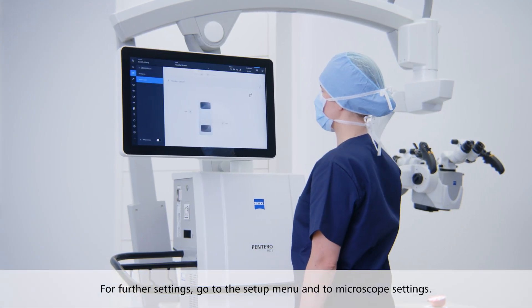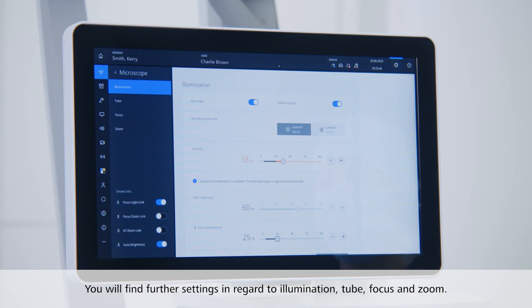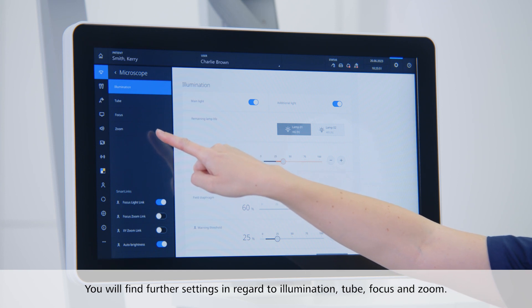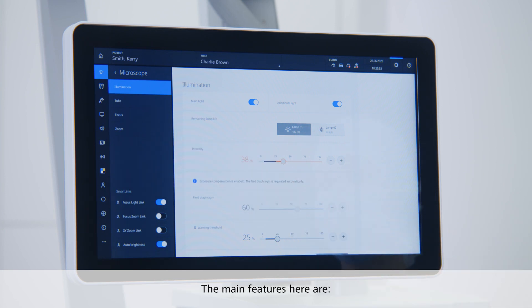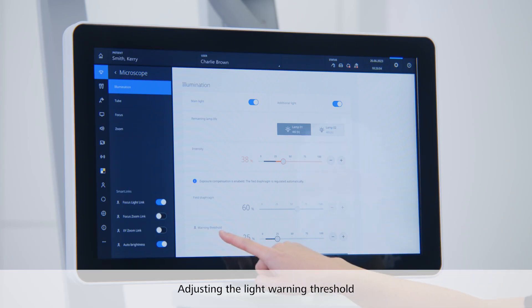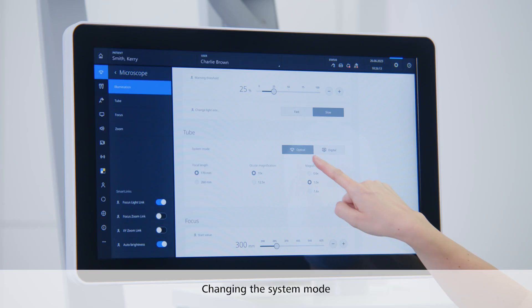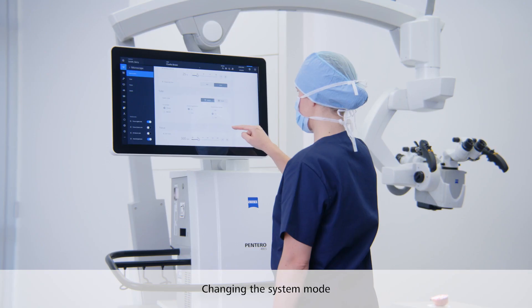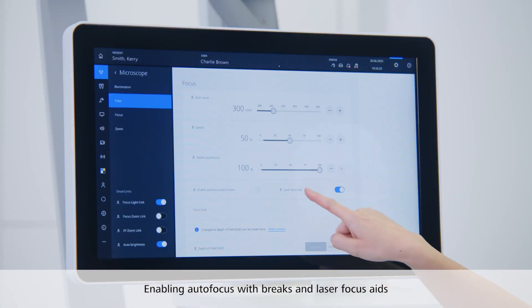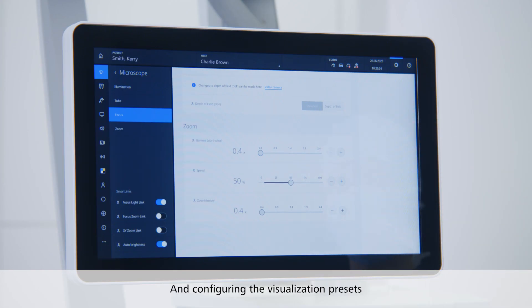For further settings, go to the setup menu and then to microscope settings. There you will find further settings in regard to illumination, tube, focus, and zoom. The main features here are changing the lamp, adjusting the light warning threshold, changing the system mode from optical to digital, enabling autofocus with brakes and laser focus aids, and configuring the different visualization presets.